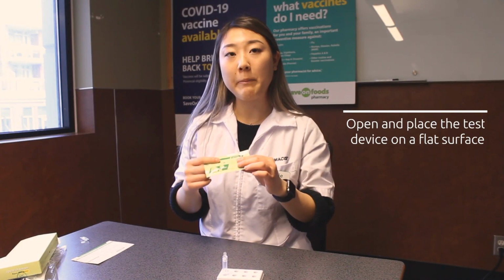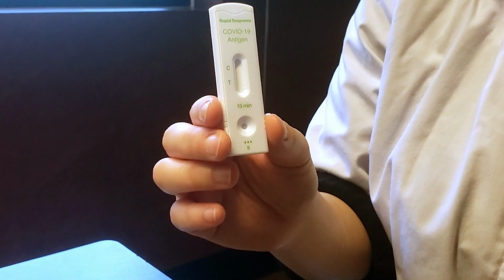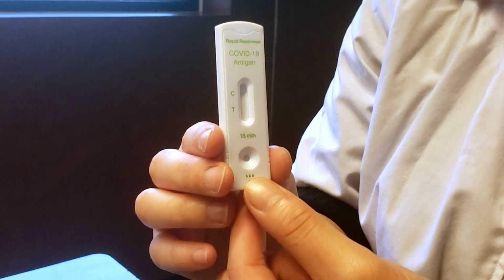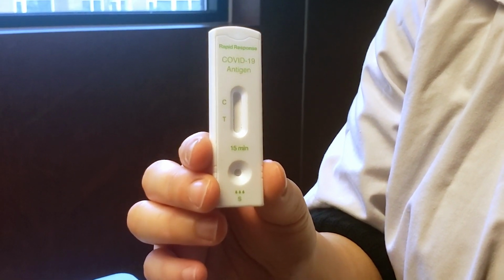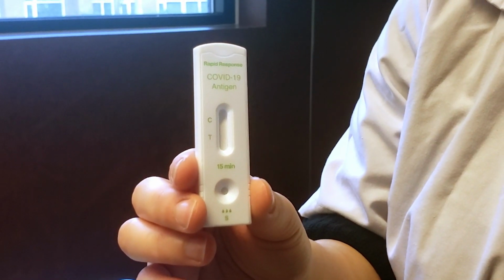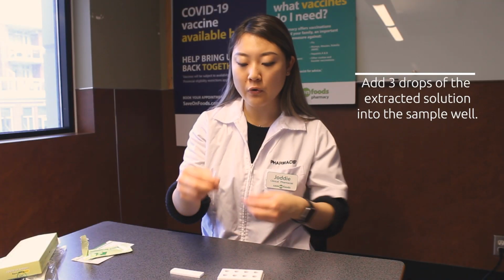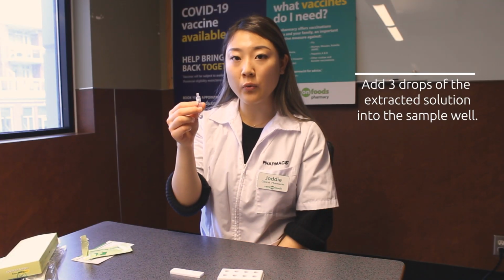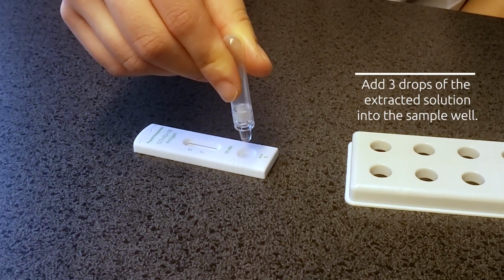You want to open up the package of the test device. In the test device, the circle part represents the sample well where you will be dropping the liquid. And this panel right here will show you the test result, positive or negative. You're going to grab your extraction tube with the nozzle on top and drop 3 drops into the test device.